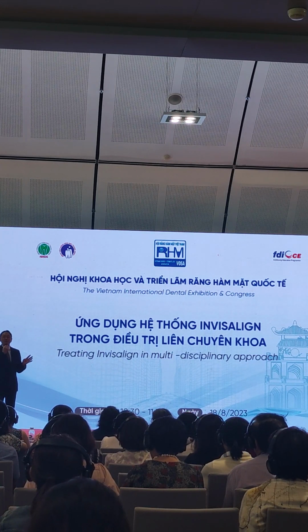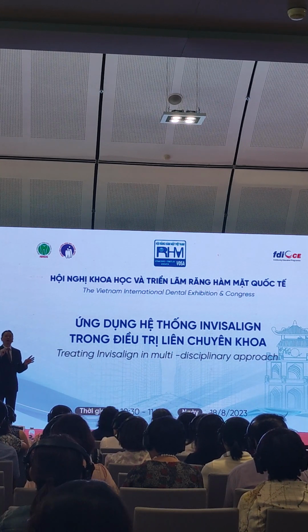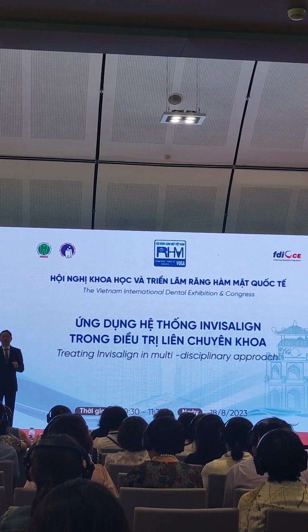It has a thickness. Also, sometimes in aligner treatment we get a posterior open bite, so we get premature contacts. And sometimes we run strong elastics. These three things have a chance to create TMD. I'm not doing research, but clinically, I hardly see patients suffer from this.